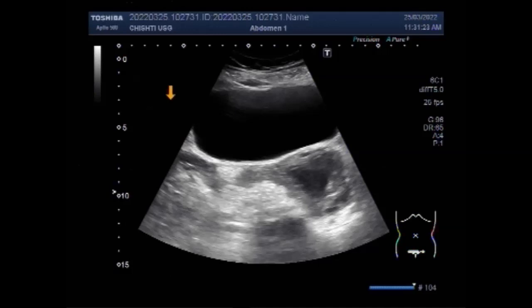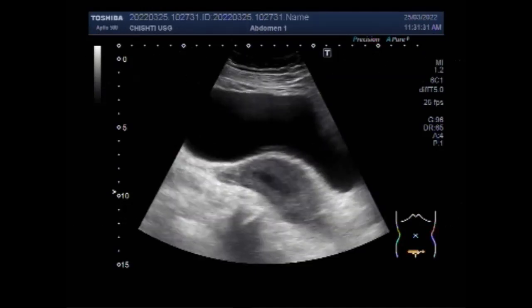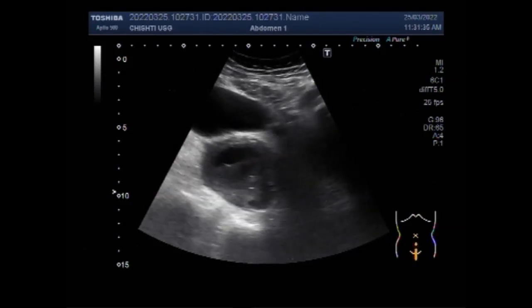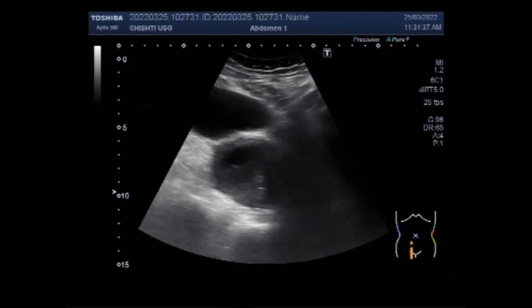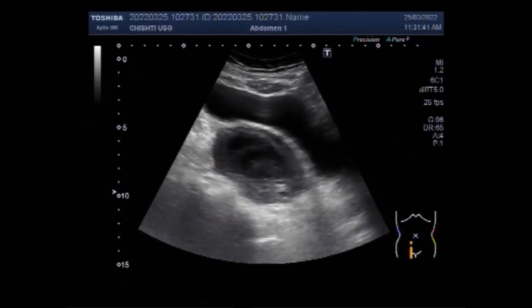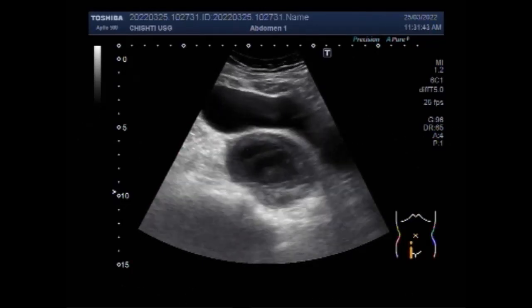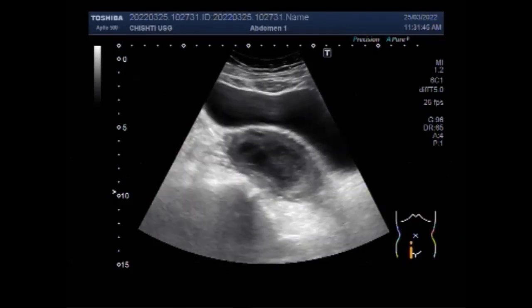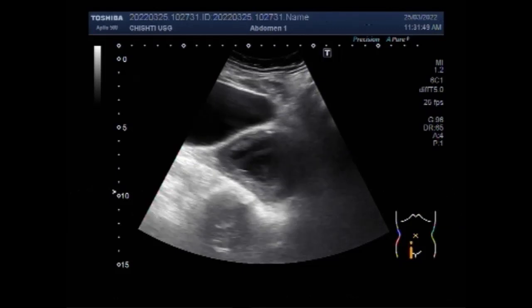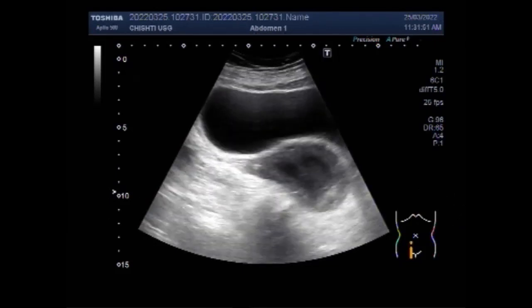Now you can see both ovaries. This is the right ovary and it has fluid in its interior, while the left ovary is echoconormal. Inside this fluid a small embryo is visible, but there is no sign of fetal cardiac activity. The fetus is not alive.